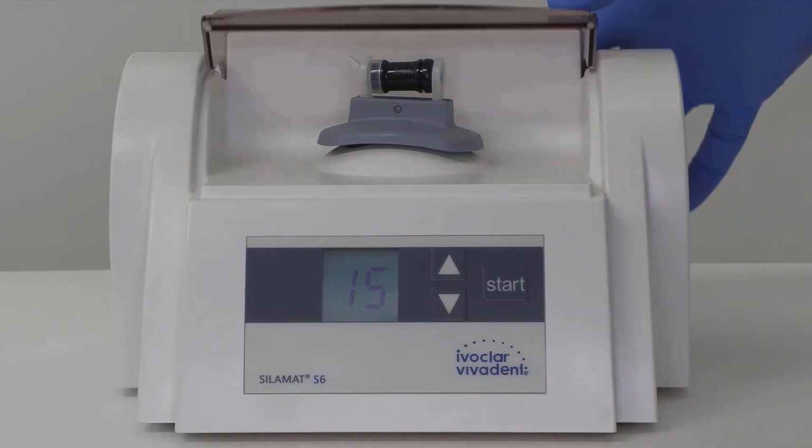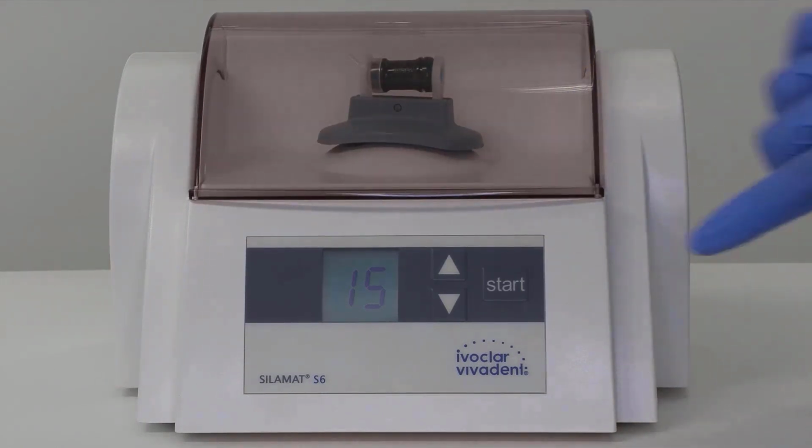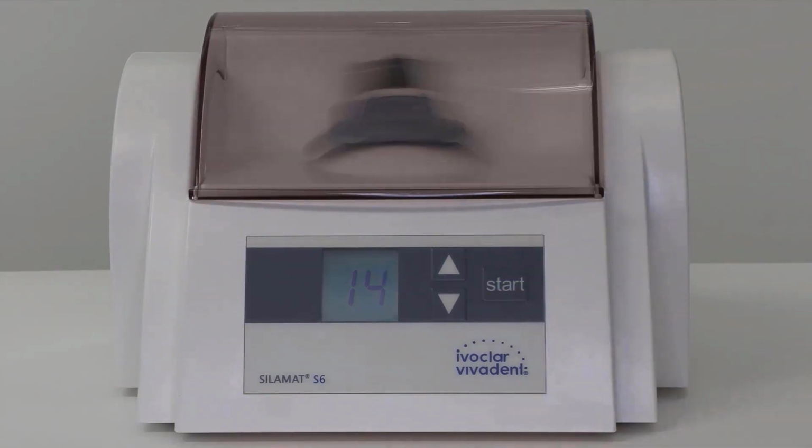Once you have inserted the capsule, make sure you close the lid before beginning the mixing process. Please note, if the room temperature is below 22 degrees Celsius or 72 degrees Fahrenheit, then more time is required to mix, so extend the time to 17 seconds. If the room temperature is above 26 degrees Celsius or 79 degrees Fahrenheit, less time is required. Set the time to 13 seconds.